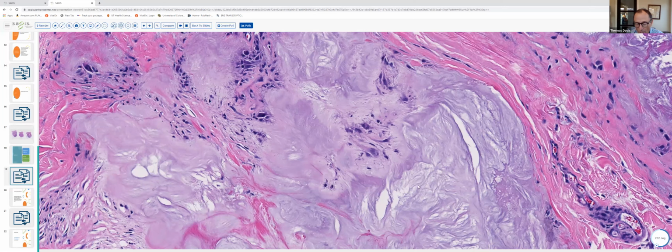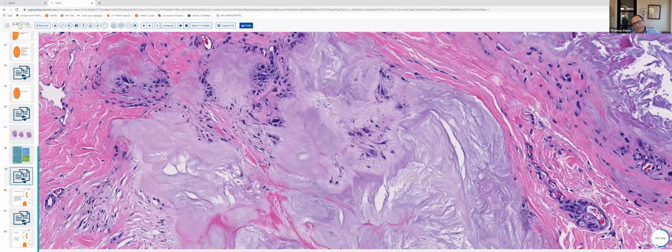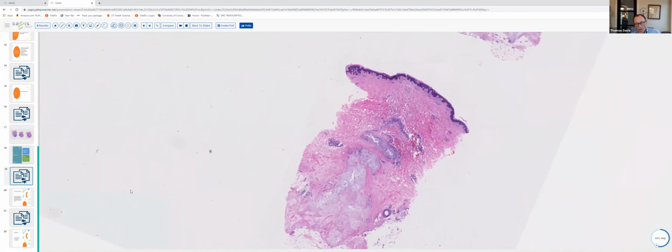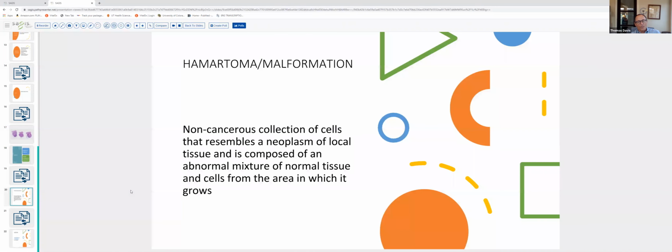Generally in gout, the uric acid crystals are dissolved with formalin fixation. So what one is left with is the matrix in which the crystals resided, and one tends to see needle-shaped clefts. I just wanted to show you a couple of different deposits. Again, diagnosis is predicated on recognizing the material, and keep in mind, deposits can be both endogenous or exogenous.